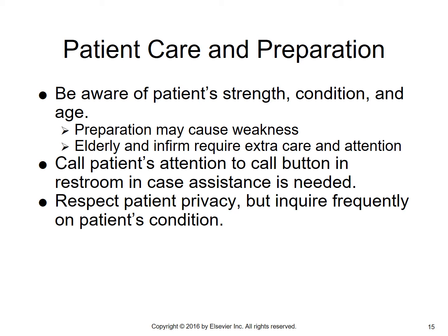You're going to have the patient go to the restroom to evacuate the barium. So make sure that you let them know that there is a call button in case they feel faint or any assistance is needed. And you always want to respect the patient's privacy, but inquire frequently on the patient's condition. So, a little knock on the door every couple minutes, are you doing okay? It is very helpful.